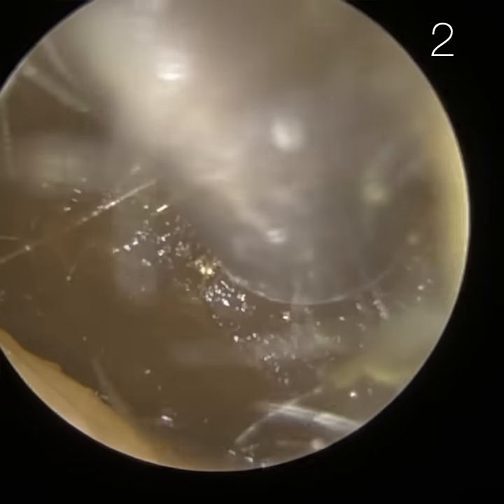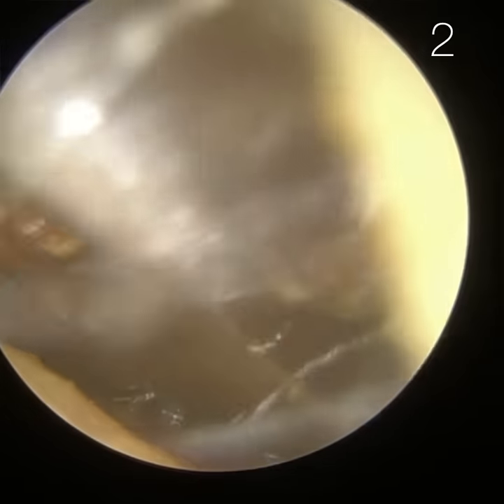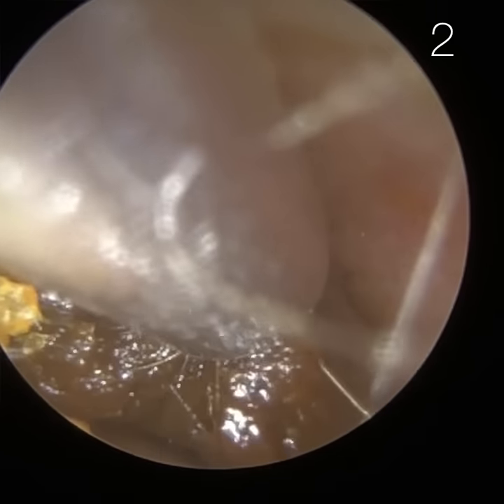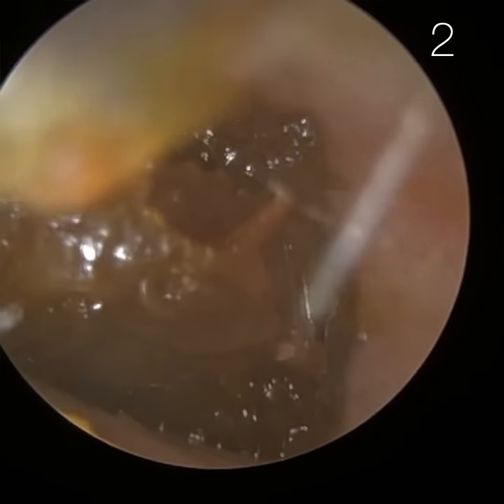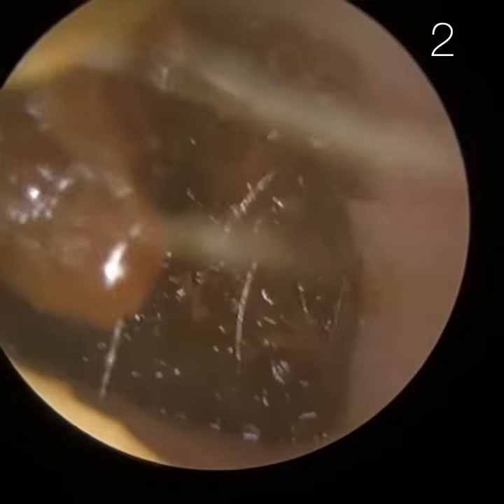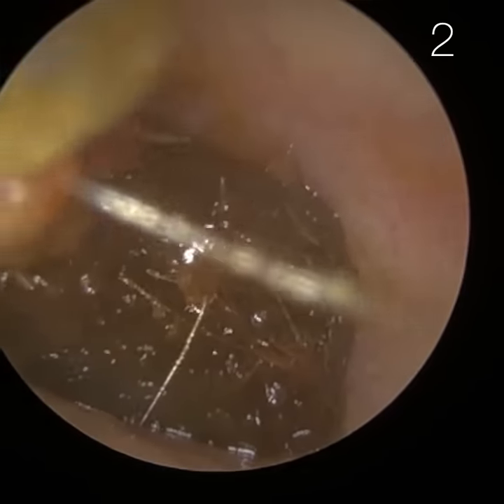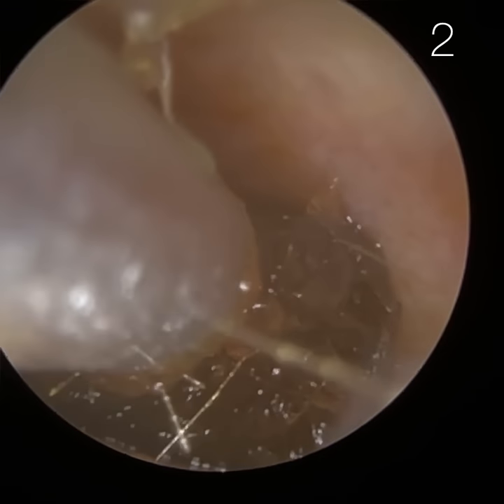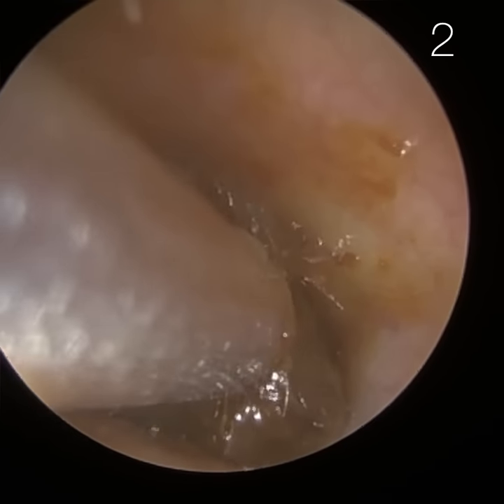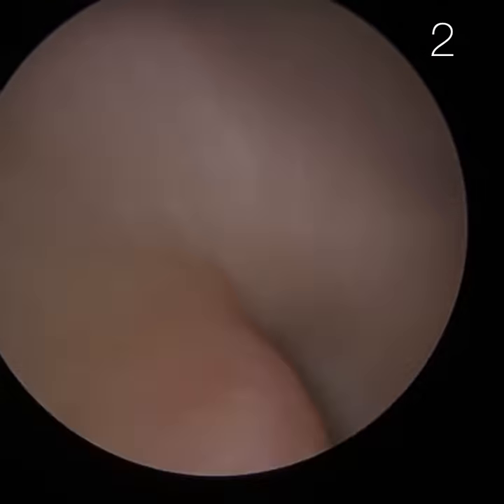Patient one is done. Patient two is very similar — it's their left ear again. Weirdly enough, quite commonly, if a patient attends with earwax in one ear, it just seems to be the left ear more than the right. I'm not sure there's anything more than coincidence, but it's something that always makes me think. This wax is a bit softer, and we have used some oil. I'm just slowly removing it. This is a slightly longer one because they've got quite a bendy ear — I'm having to go all the way to the right, stretch the opening, and then insert the suction probe.